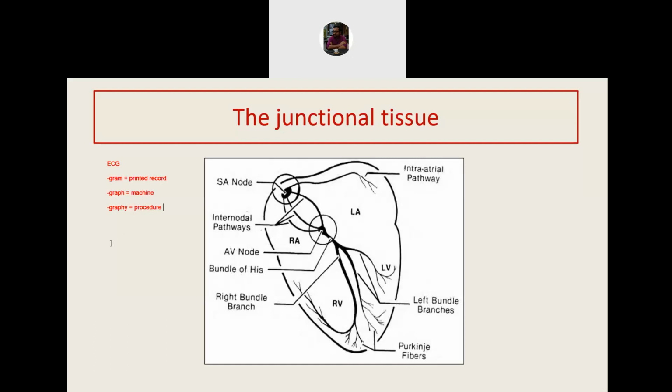So the property that enables us to record the ECG from the body surface is volume conduction. And that is why the human body is also known as a volume conductor. So a conductor where a charge or potential generated at any part in the depth of the body can be recorded from the surface with some degree of precision. So this is the property of a volume conductor. The body is a volume conductor because of the presence of electrolyte solutions all over the body.